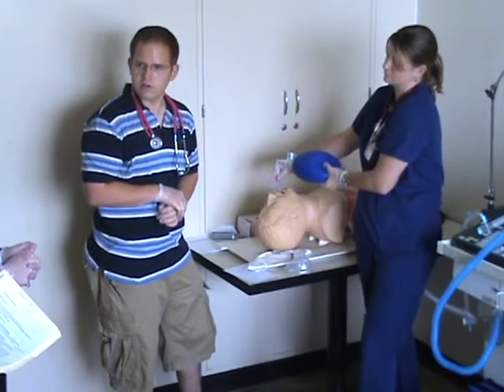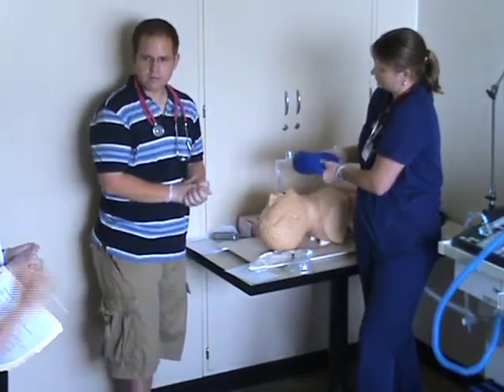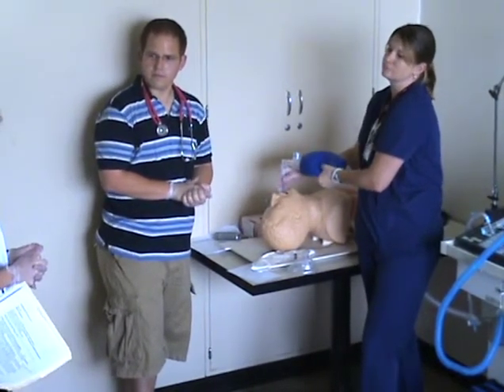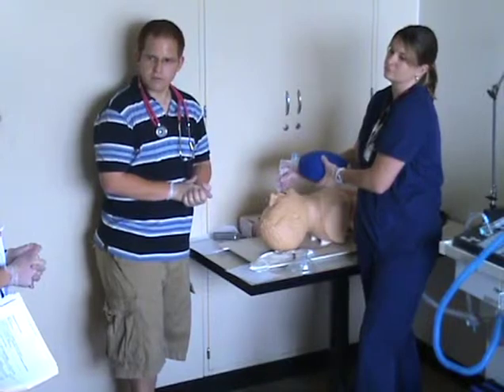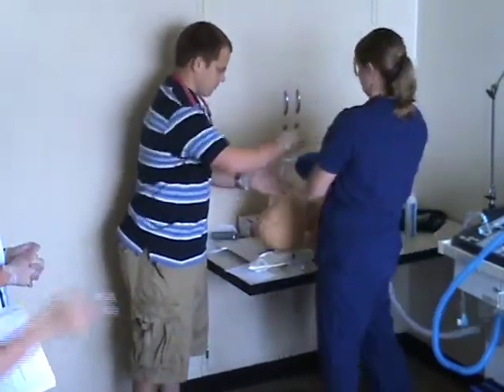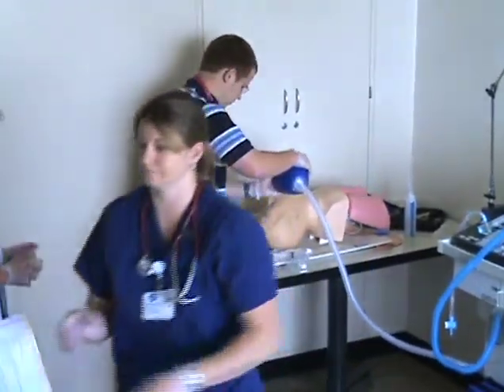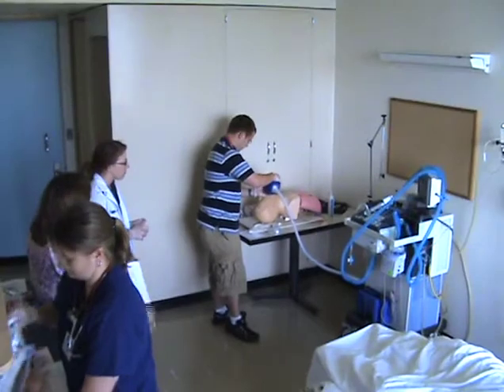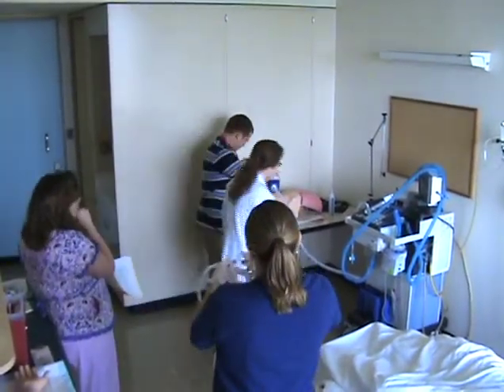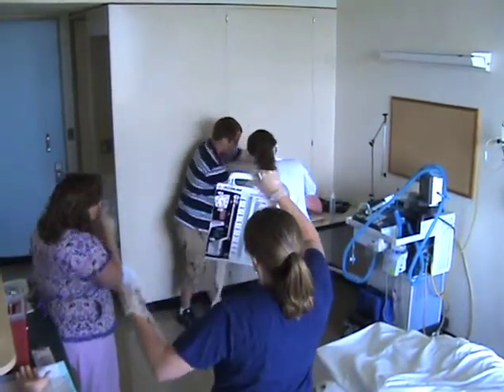Okay. All right, so we have done that. You have performed your needle decompression, and you do have a chest tube. So while you're preparing to put them on the ventilator, we're going to have Mandy go ahead and get the chest tube. You want to take your chest tube in? Ready. Sure. And if you want to help him while he gets, you want to secure the tube. Hold this. Just and then get the ventilator, okay.